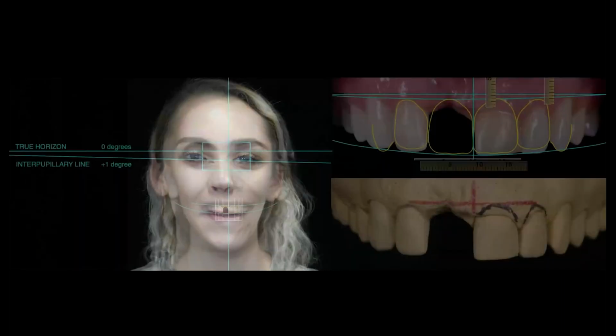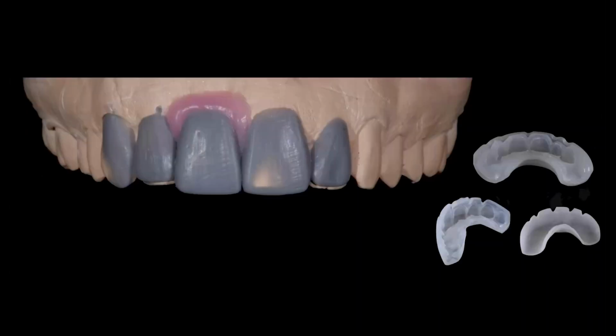But what's interesting is when we start to look at where we want to put her tooth, and again, I'm not going to go too far into the case just for time. She had an implant placed years ago. Not critical for us, except we're probably not going to use the implant because of where it is.